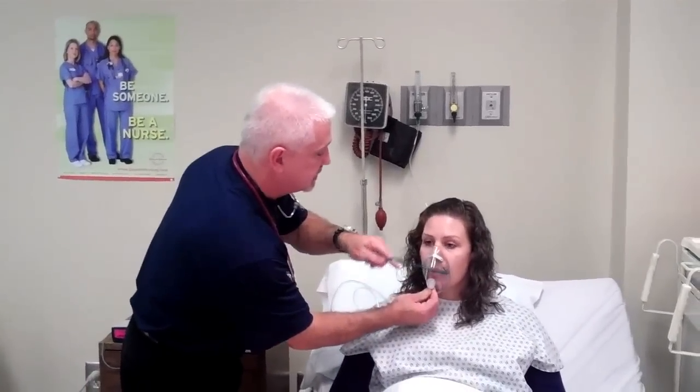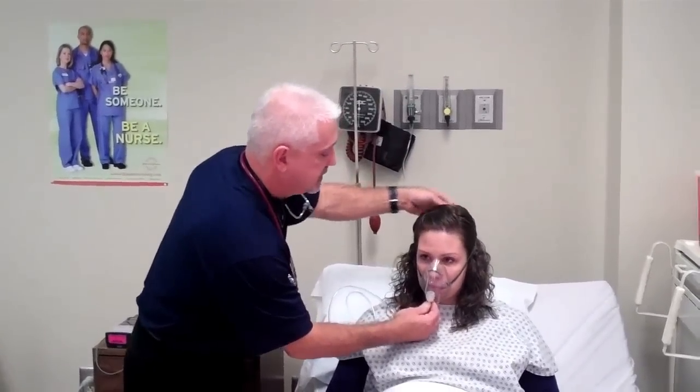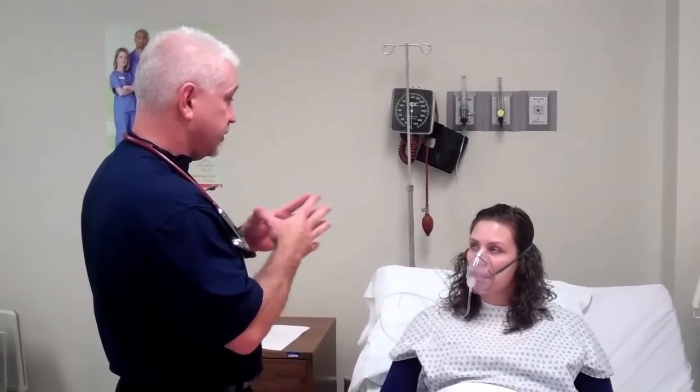I'd place the mask on the patient, make sure there's a comfortable fit, and ask if it feels okay. Then I'd reassess the patient's heart rate, respiratory rate, SpO2, color, and level of dyspnea. I'd remind her: check with the nurse before using any hand or facial lotions, absolutely no smoking, and if she starts feeling lightheaded, dizzy, nauseous, or experiences shakes or tremors, let the nurse know and limit use of electronic devices.